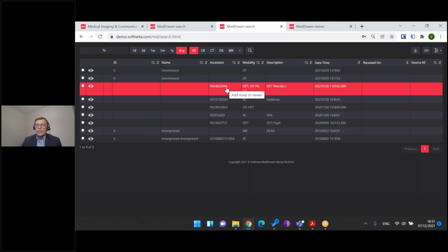So when you place it in the new hospital, which contains several new devices of OPT, OCT, you need to count several months of additional development, which will be done to support these devices, and then they will be presented correctly. So this is quite important to know, but as most viewers, they even do not support that format. So this is a unique selling point to our partners.